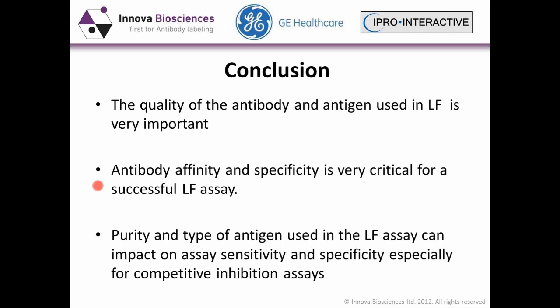analytes. And also in the case of small molecules, the type of antigen or the type of hapten carrier molecule one uses would have an impact as well, in terms of the substitution ratio of the hapten molecule with the carrier protein. It can have an impact on the sensitivity of the assay, especially in competitive inhibition assays.